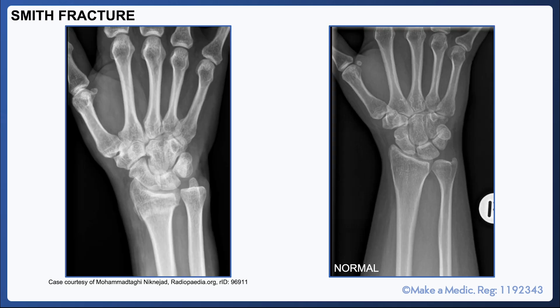A Smith fracture is sort of the opposite of a Colles' fracture, in that it's a distal radius fracture in which the distal fracture component is displaced in a volar direction. It typically occurs after a fall onto a flexed wrist. As you can see on the PA view, it can look pretty similar to a Colles' fracture — the distal radial contour is no longer smooth, and there is a loss of radial height.